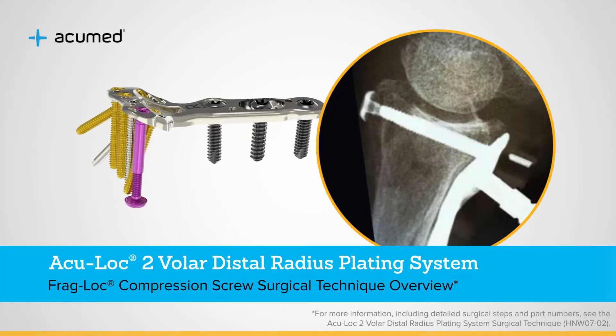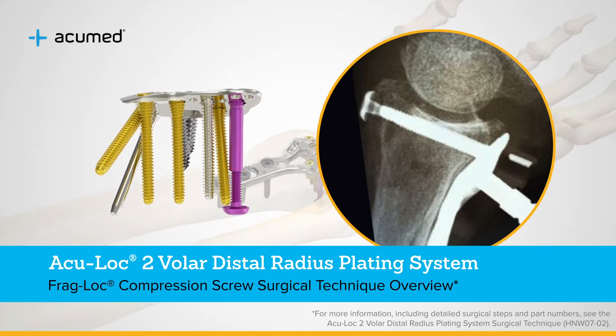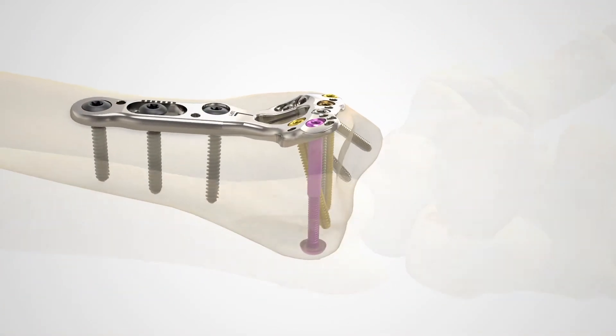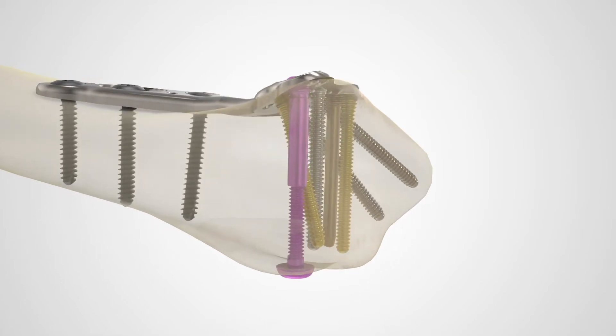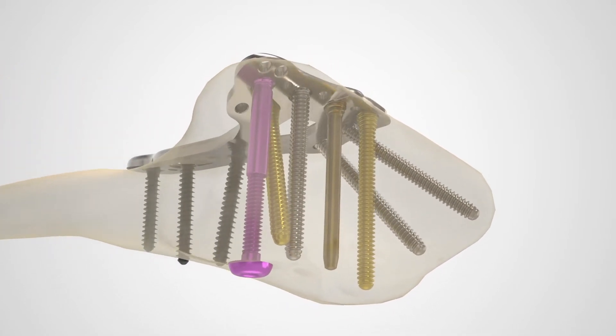The FragLock compression screw is a two-part cannulated screw designed to reduce dorsal fragments to the AccuLock II VDR plates, distal radius fragment-specific plates, volar lunate suture plate, AccuLock VDR plates, and AccuLock EX plates.